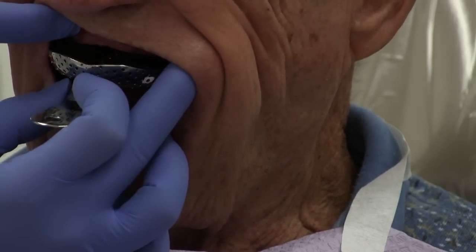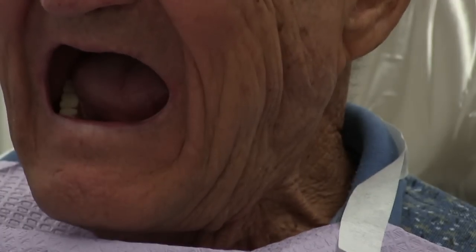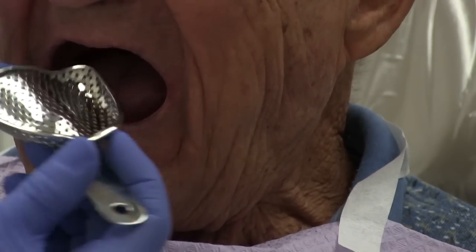This is the perforated, reusable, sterilizable edentulous tray — not a dentate tray. It's an edentulous tray.